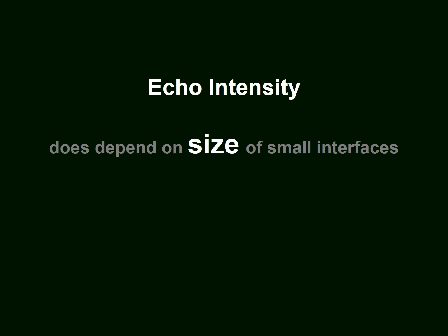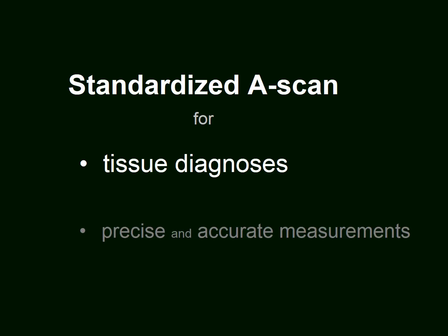So the echo intensity does depend on the size of small interfaces. And therefore we can use standardized A-scan at tissue sensitivity for tissue diagnosis.